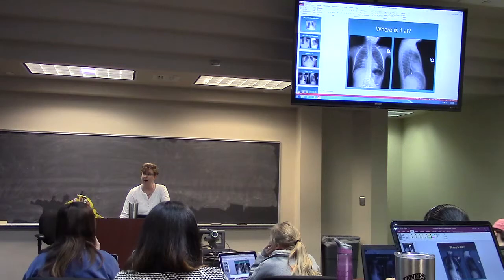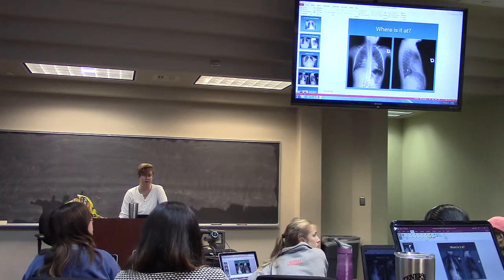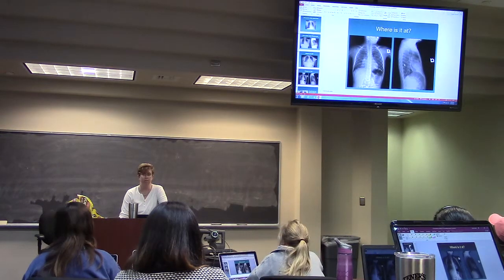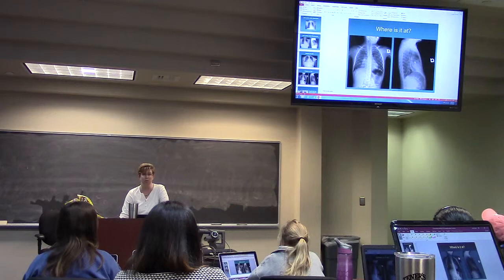You actually have middle and lower in this picture. Because look at this. See how the streaking comes down? And what happens to my vertebral bodies? No, you can't even see them really. They're covered up with infiltrate, infection. And there's something going on right here. So we have both a middle and a lower lobe, which happens all the time. Pneumonias don't happen in one lobe.